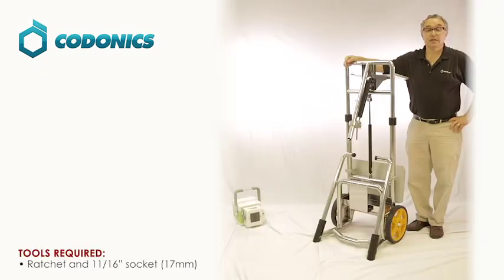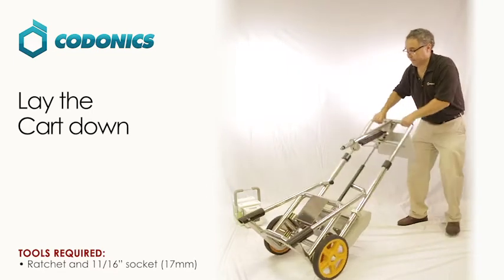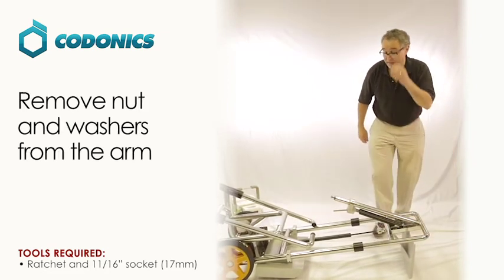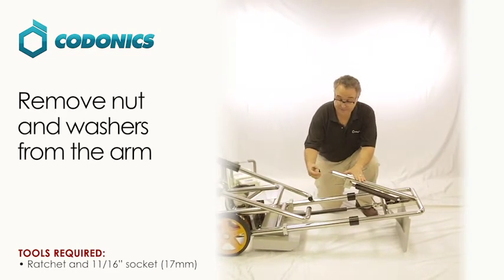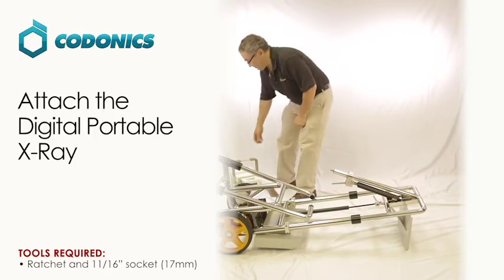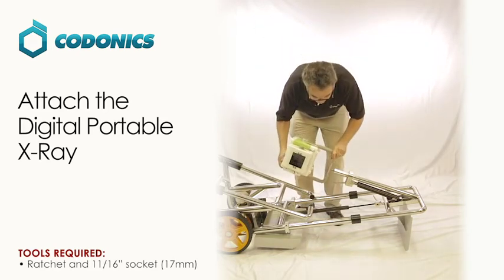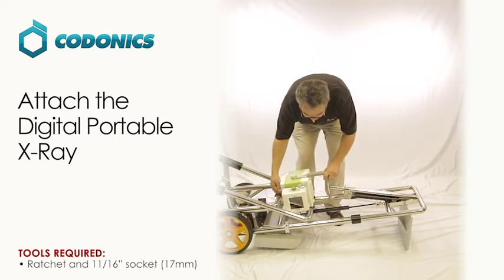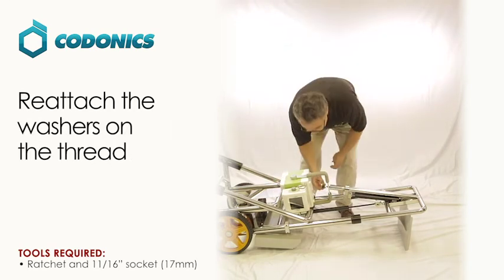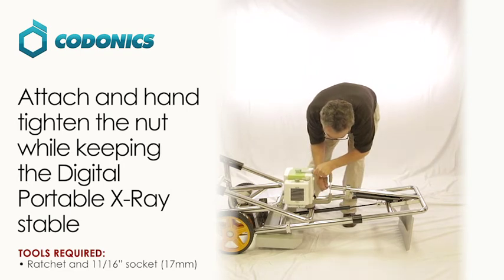Now we're going to discuss connecting your Codontics digital portable x-ray device to the cart. The first step is to lay the cart down. Next, remove the nut and the washers that are on the arm. Pick up your digital portable x-ray device and place it on the threaded arm, letting it rest down. Place the washers on the threads, then place the nut and hand tighten it as far as you possibly can.